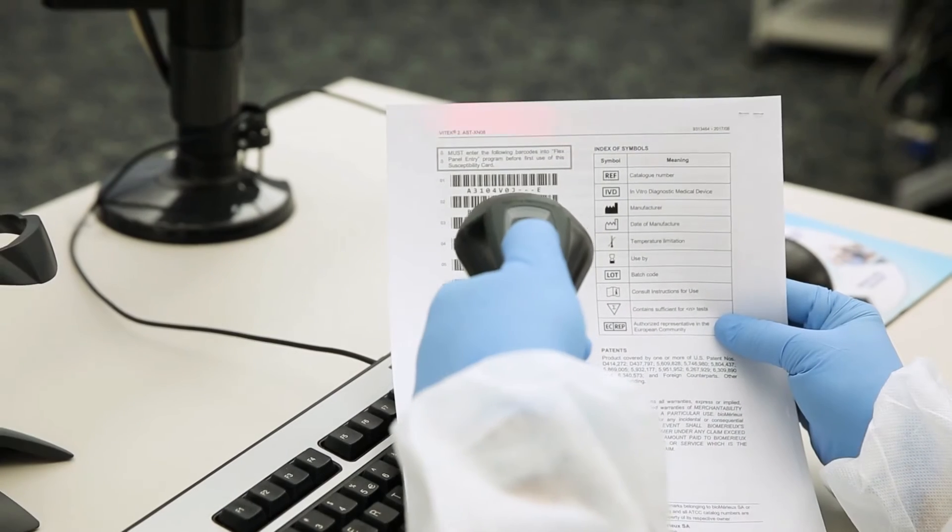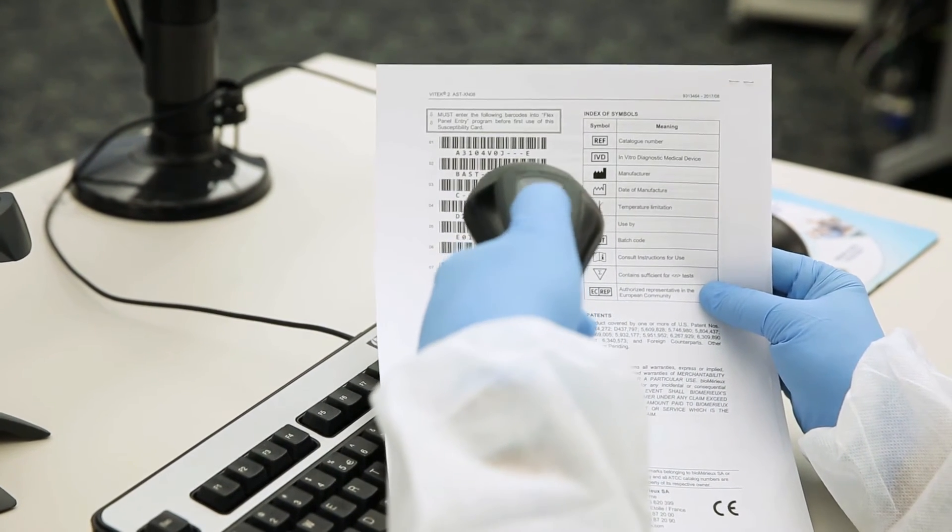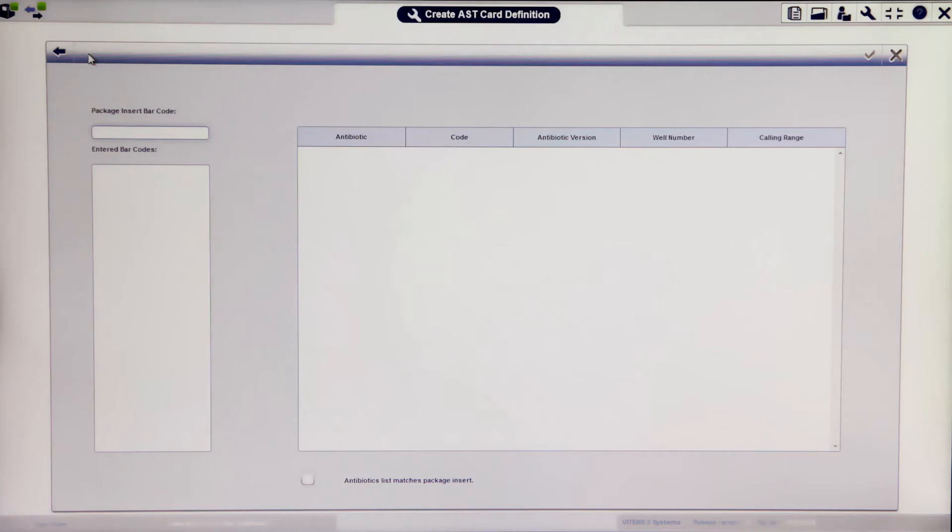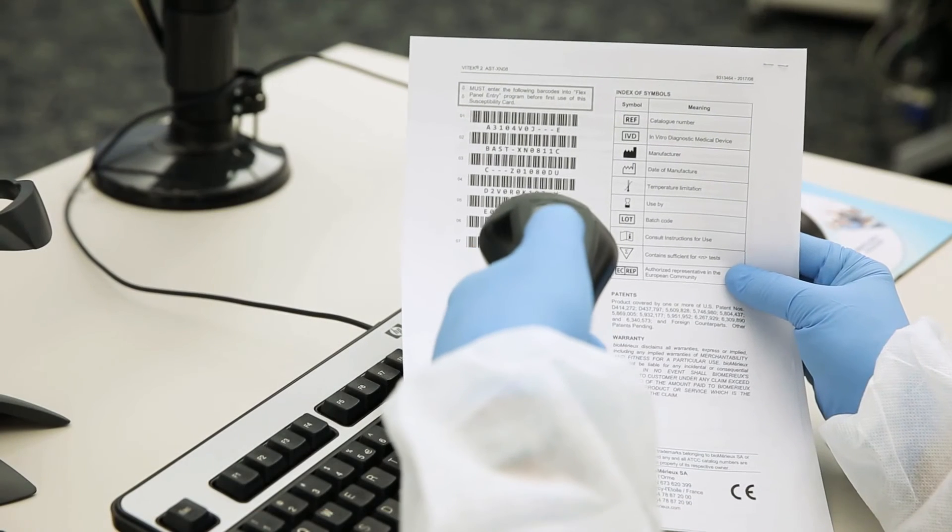Scan all of the barcodes on the new cards package insert. As each barcode is scanned, drug information will be added to the screen.